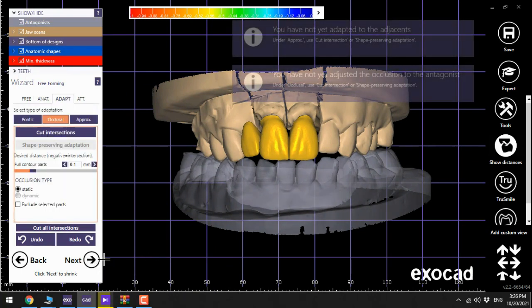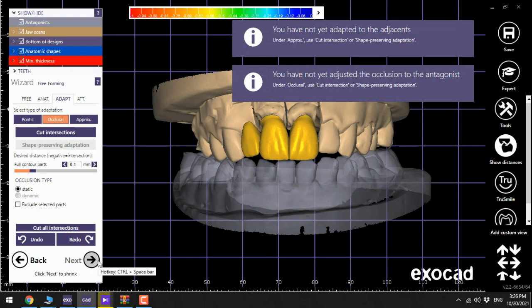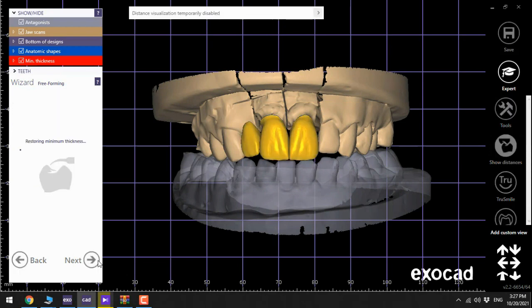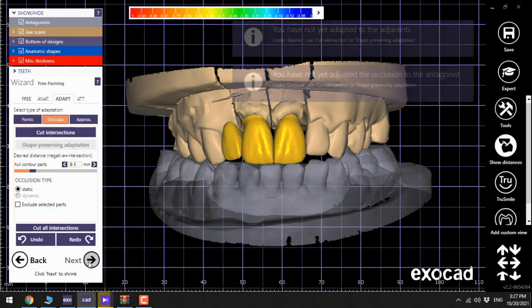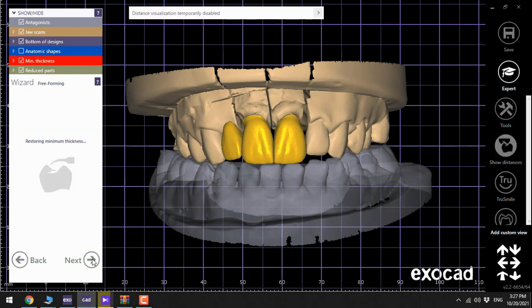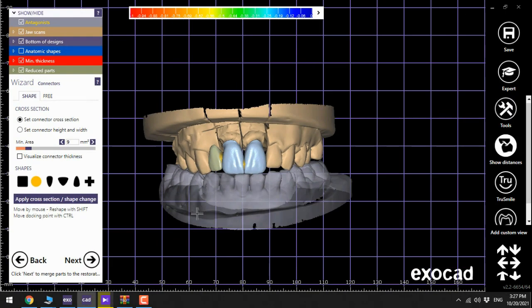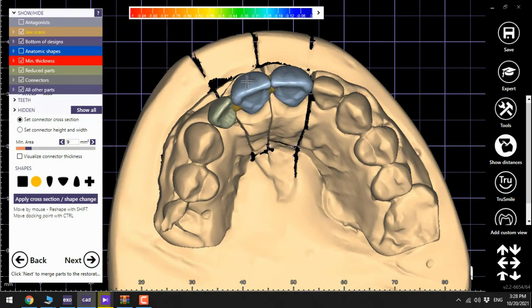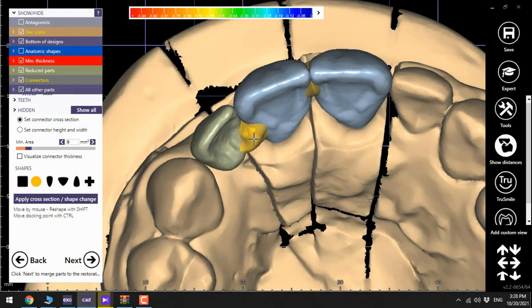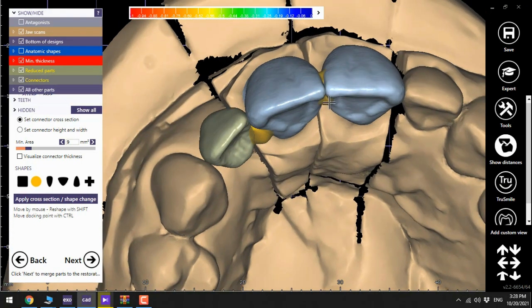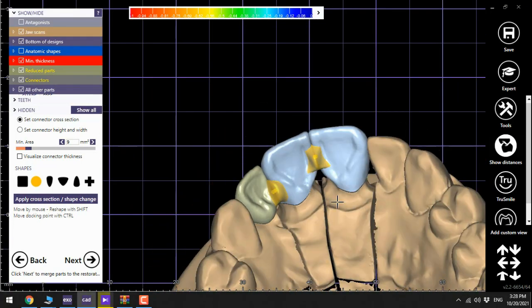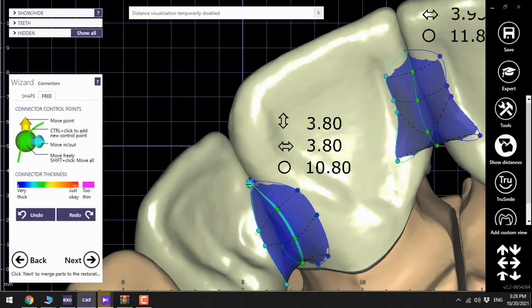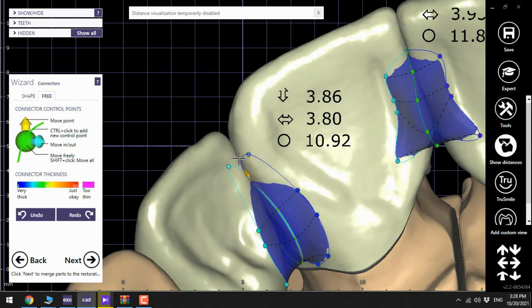Click next. Now, we go directly to the connectors. We place them usually on the lingual side, like this. Make them as strong as possible.